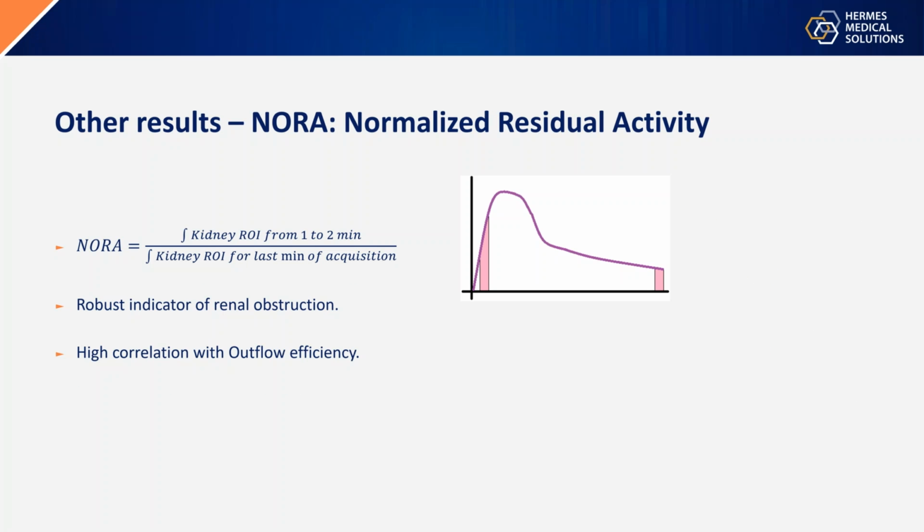If it's a very dilated pelvis, the outflow will be either delayed, or if you have an obstruction, not at all, causing it to be very wildly inaccurate, I'd say, since we do have ranges in which the Nora should fall in order to estimate this. But on the other hand, if the excretion is very late, then you would also get a very odd number for the Nora indicating this. But of course, you might then misread it as an obstruction. But I mean, it would be possible.